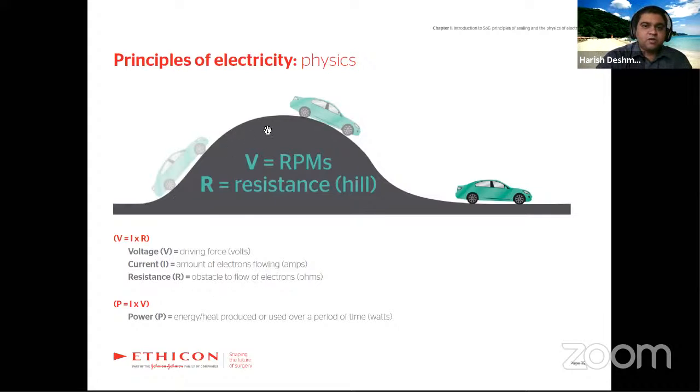So when you come to obstacles, you will increase your accelerator, so you're giving more power, more current will be given, and voltage will also increase, because they are directly proportional. In case of downhill, it will go the opposite way, because resistance is low, so your current and the voltage both will reduce.